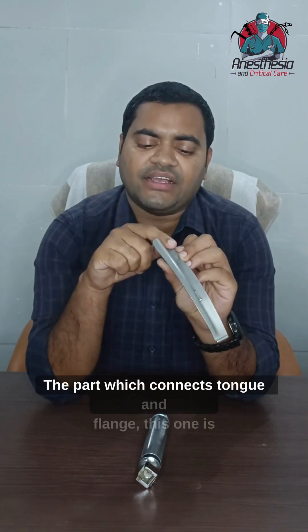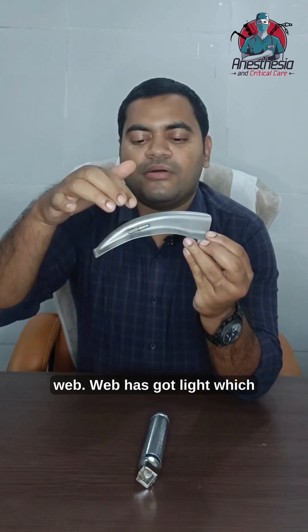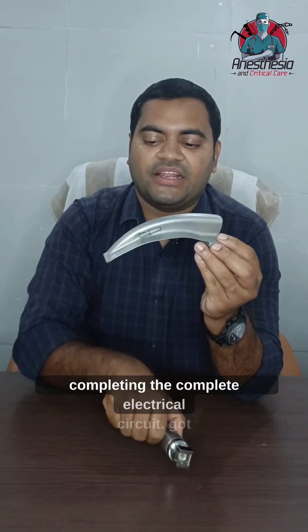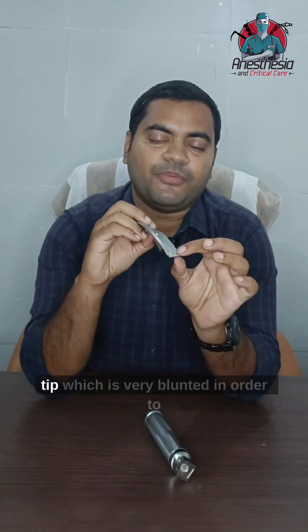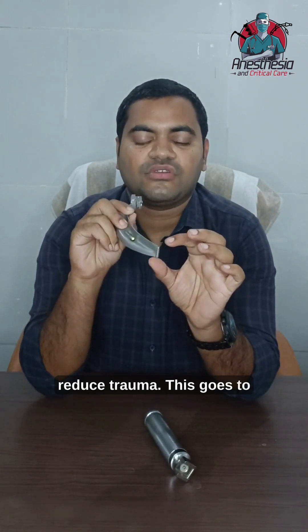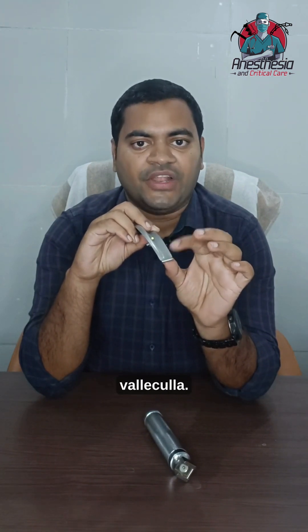The part which connects the tongue and flange is called the web. The web has a light which illuminates when you connect the handle by completing the full electrical circuit. The blade has a tip which is blunted in order to reduce trauma. This tip goes to the glossoepiglottic fold or vallecula.